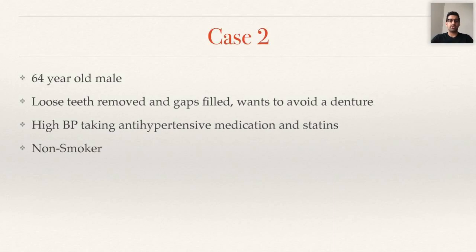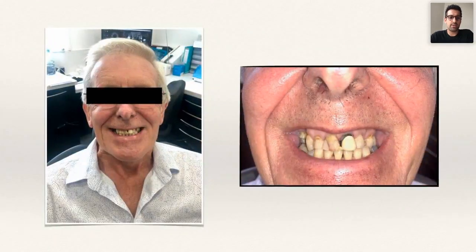So we're going to move on to case two. So this is a 64-year-old gentleman. Again, loose teeth. He's got gaps and he wants to avoid a denture. Medically, nothing too much to worry about. And again, he's a non-smoker. I do tend to only treat patients that are non-smokers. Okay, so here he is.